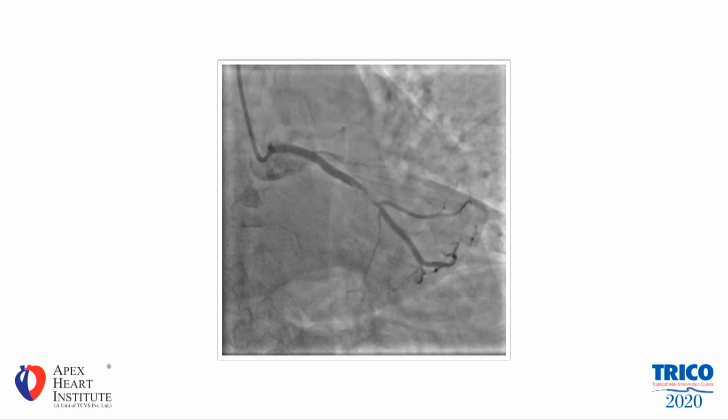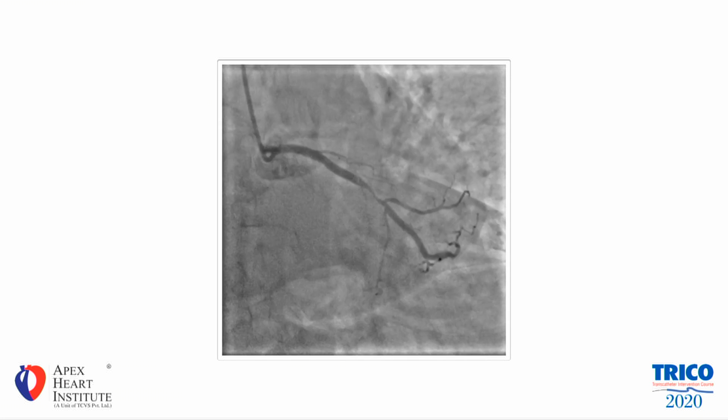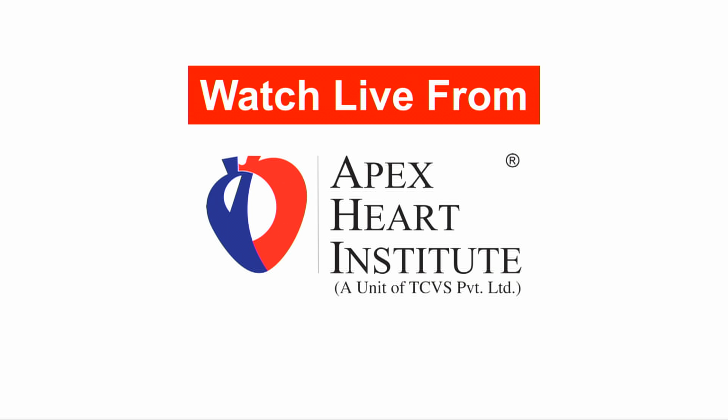Medina 110, and LCX having stenosis of around 95%. So plan is LAD bifurcation plasty and LCX plasty.